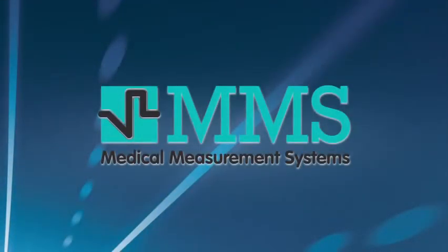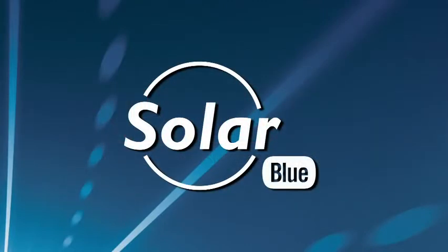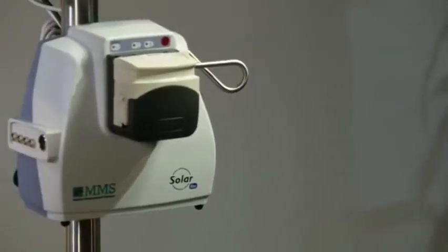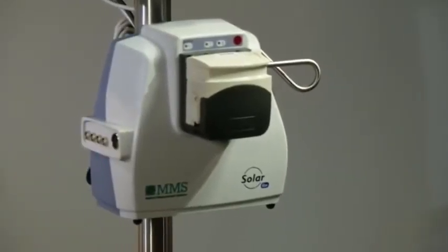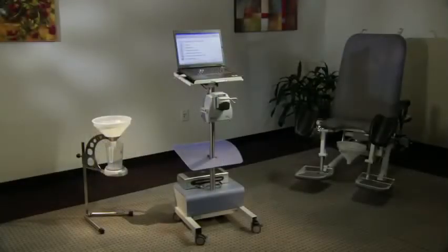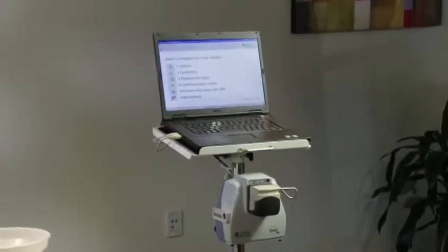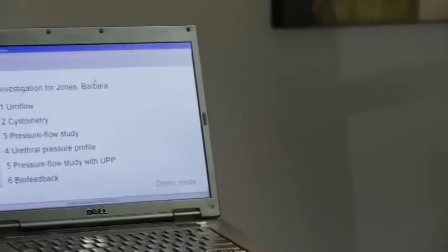Medical Measurement Systems is proud to introduce the SolarBlue Urodynamics System, an advanced diagnostic tool designed to improve patient care and enhance your practice. The SolarBlue Urodynamics System is a small, wireless, and easy means to diagnose the causes of incontinence and other urological disorders. It is without a doubt one of the simplest full-functioning urodynamics devices on the market.